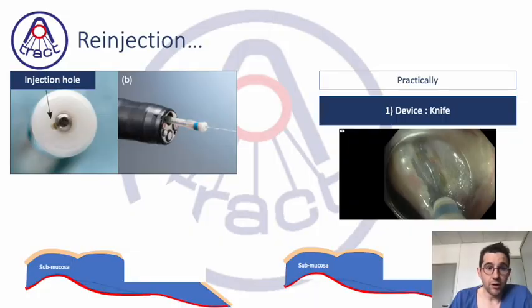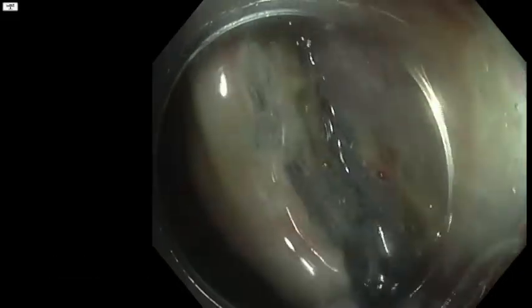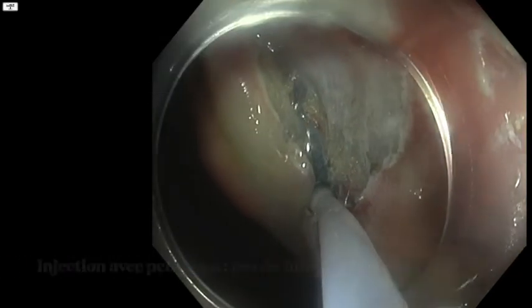So here you have the dual knife jet with the small hole of injection close to the needle, and to do a proper injection with the knife, it is better to make a small hole before injecting, because you will create a kind of isolation of the tip of the knife in the submucosa that makes the injection more effective.